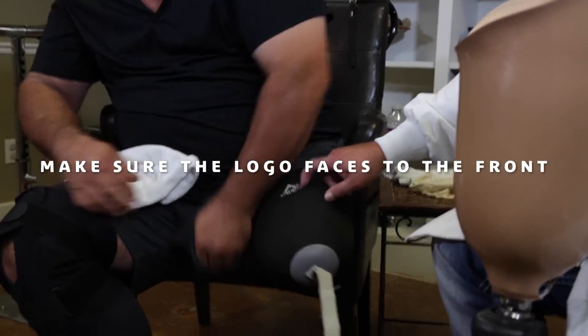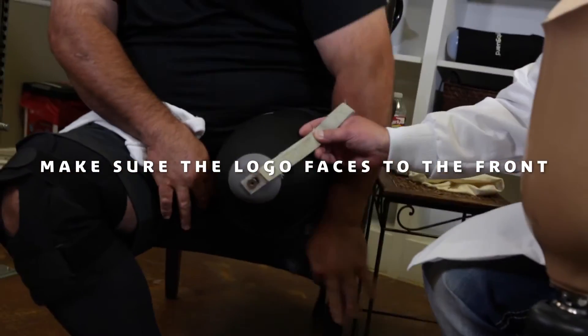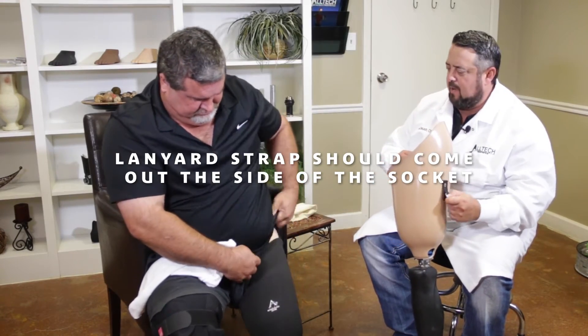He always makes sure that the 'A' is in the front, so that the lanyard strap is on the side. The lanyard strap is going to come out of the side of the socket and attach here — this is what holds the prosthetic onto his limb.